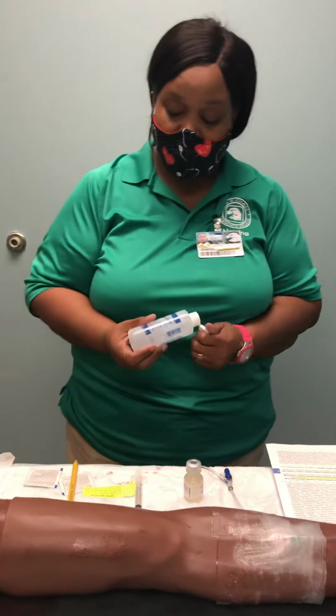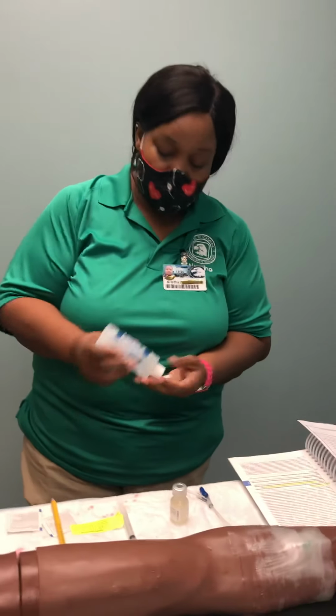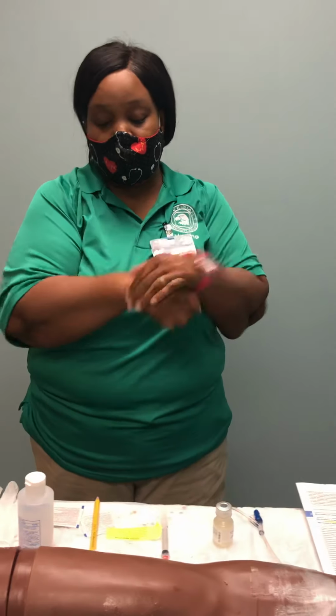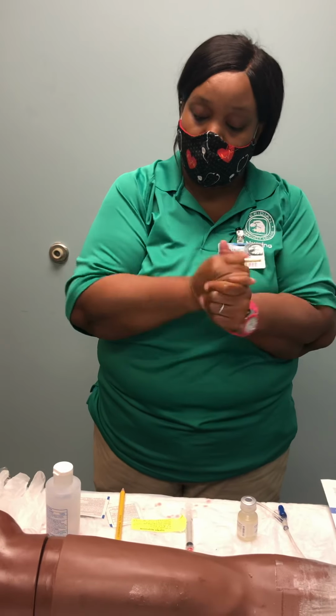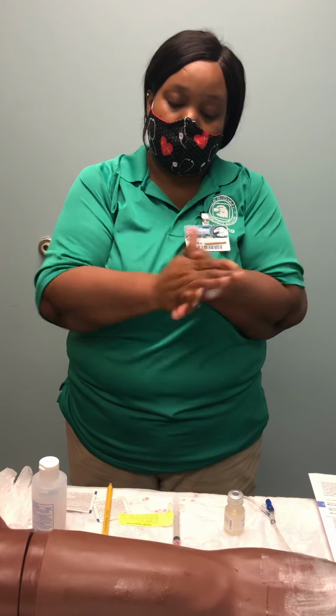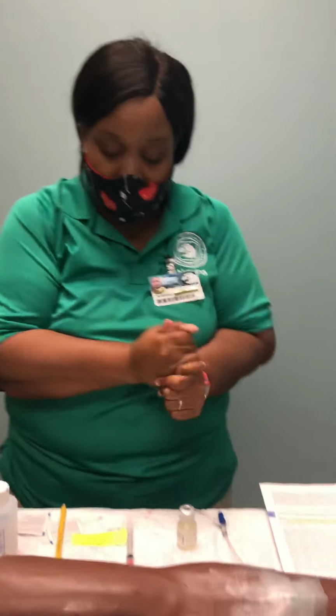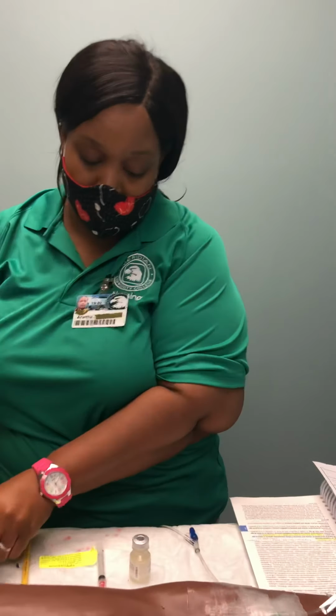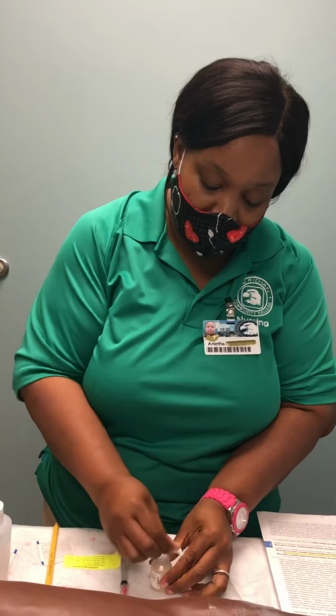Before I touch the medication, I am going to wash my hands. Okay, after I wash my hands, I am going to take an alcohol prep and wipe the top of my medication off.